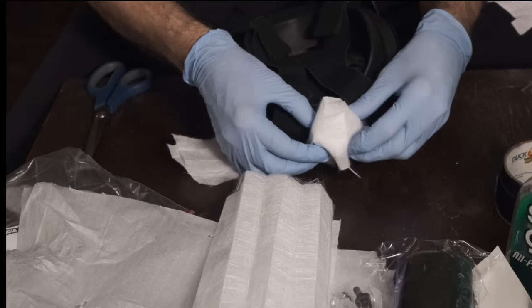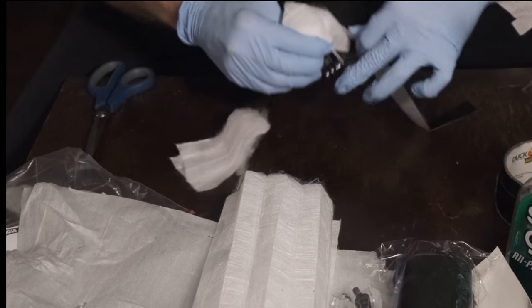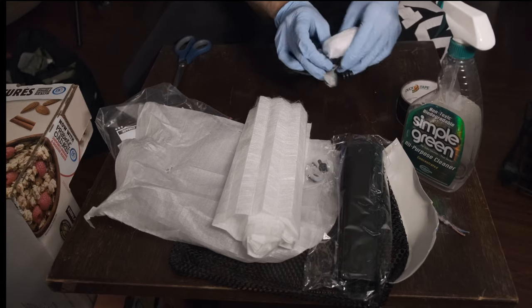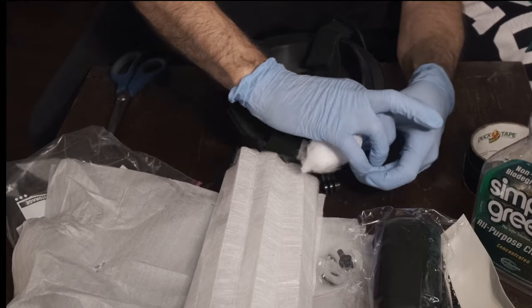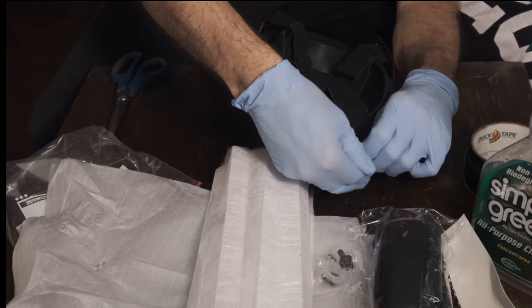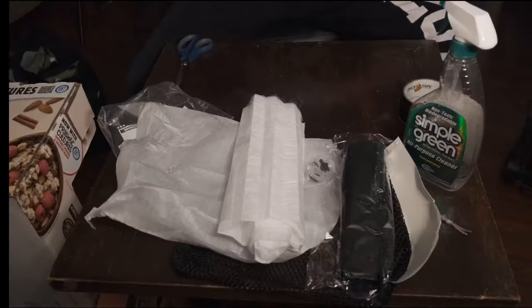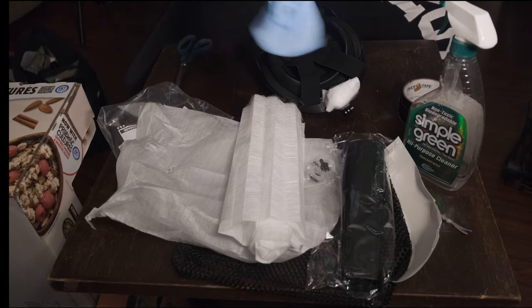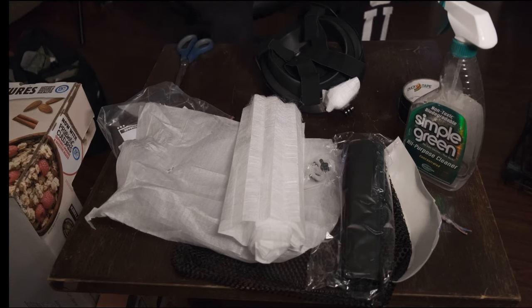I wrap it like that and fasten it tightly around. I might have to take my gloves off to do this. I think it's now safe because if there's any virus on these gloves the filter will block it, so I'll take the gloves off. I'll dispose of these and be back shortly.